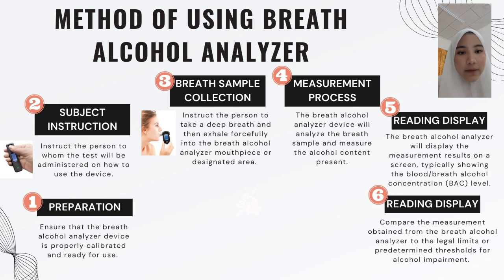For the third step is breath sample collection. Instruct the person to take a deep breath and then exhale forcefully into the breath alcohol analyzer mouthpiece or designated area. The person should continue blowing until prompted to stop. So for this one, the person must start blowing when the display shows the blow sign.